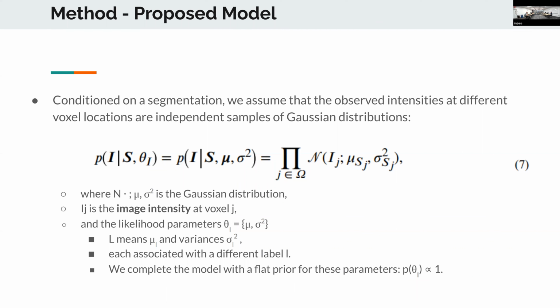So basically, they have the deformed atlas, and in the deformed atlas they have a region with some thousands of voxels, say 125,000 or something, that belong to some region. And they say, okay, all of those voxels that belong to some label are distributed like that. The probability of all of those voxels having this label goes according to this distribution, regardless whether this voxel is closer to the center of this contiguous region or closer to the border with another region, which in my view, the probabilities are different of this label being.